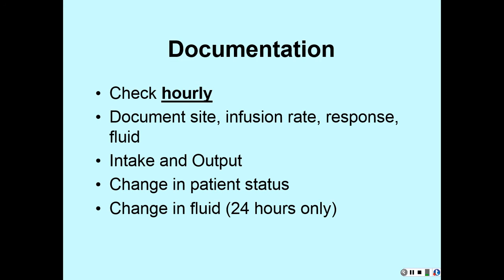And then you move on up. Does my catheter look okay? Is my tubing not kinked? Okay. And then you go on up to your pump and look, is it the right flow rate? Is my pump working correctly? Is it plugged in?